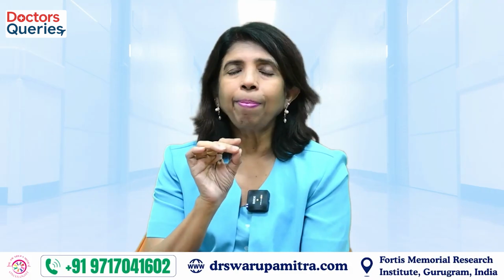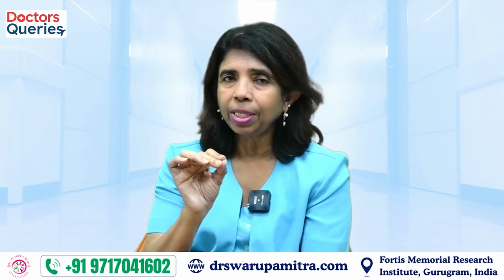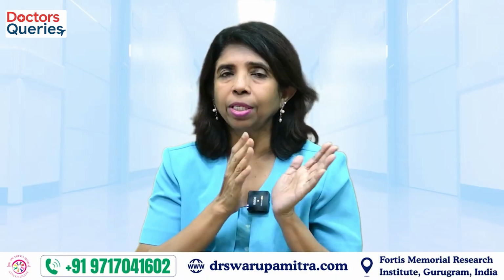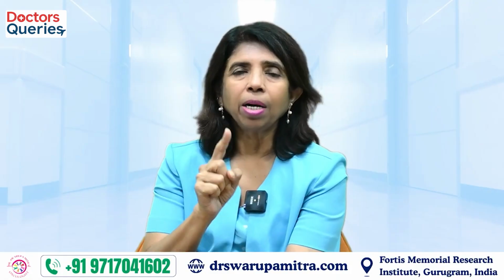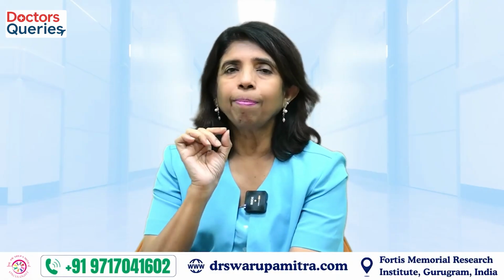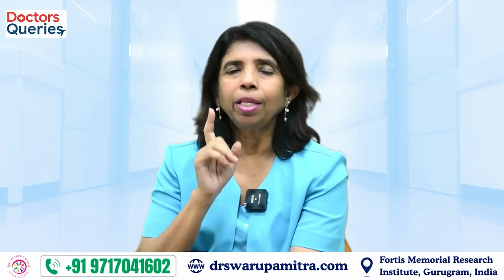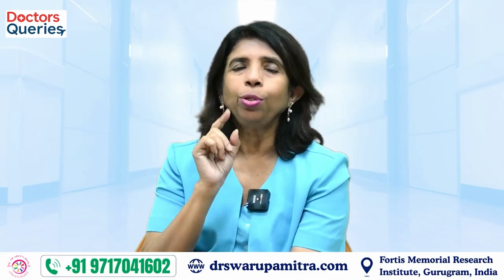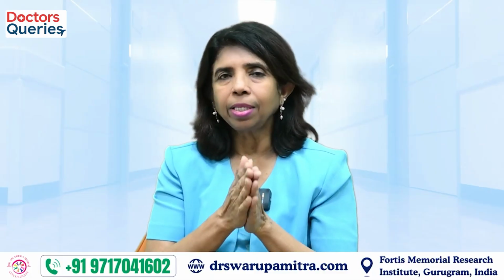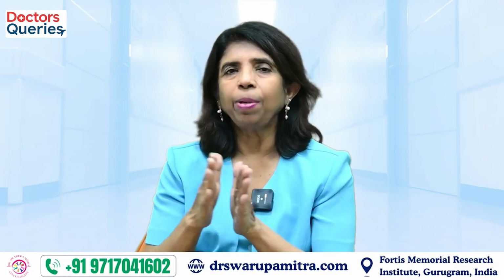As I said, we are planning for very precise radiation treatment. So when precision is important, it is also important that the patient does not move, and hence the mask is made. Many times the patient asks, is the mask to see that the radiation does not go to other areas? No, the purpose of the cast is only to immobilize the patient during the treatment. So the second step is the simulation scan and the cast, and after that the patient goes home.